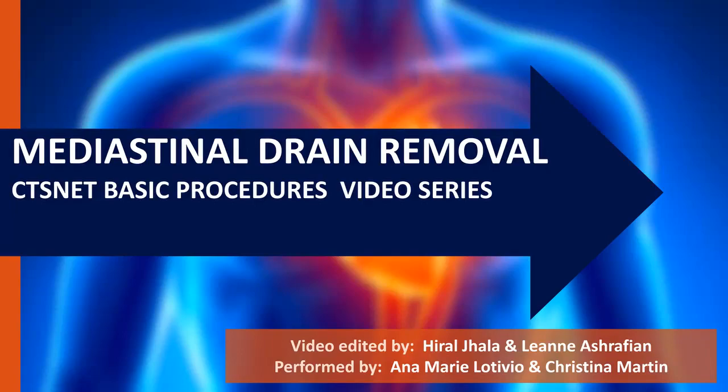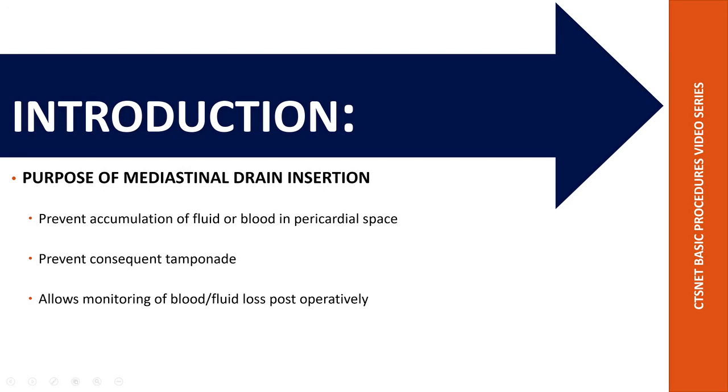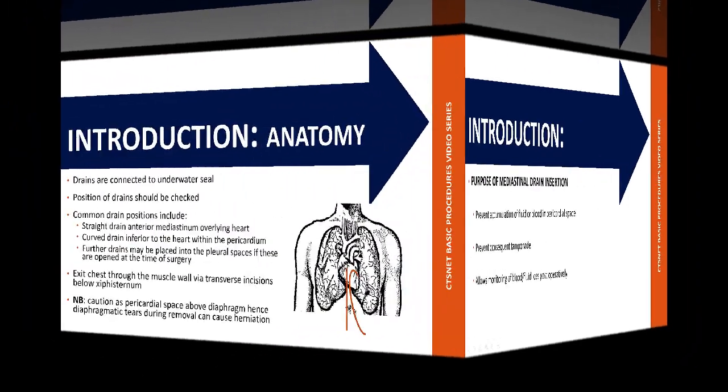Welcome to this video on mediastinal drain removal. Mediastinal drains are inserted during cardiac surgery to prevent blood or fluid from accumulating in the pericardial space, to prevent subsequent tamponade, and to allow monitoring of blood or fluid loss post-operatively.